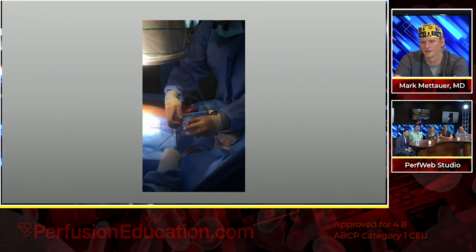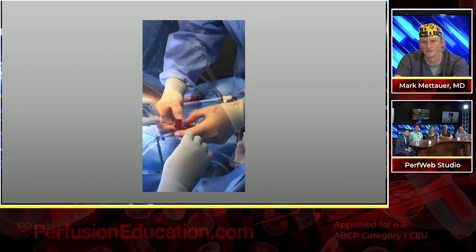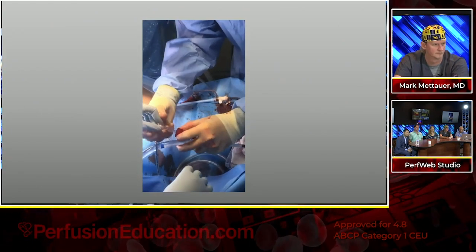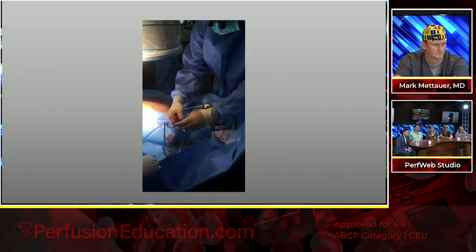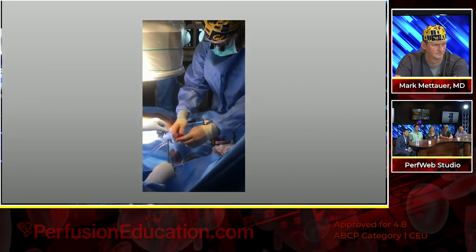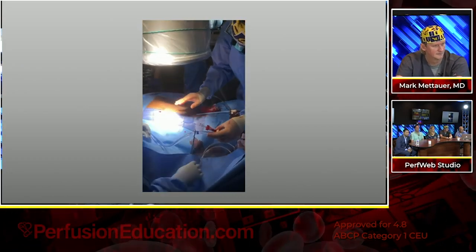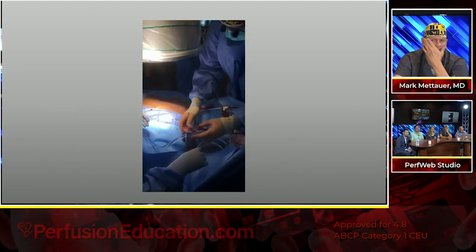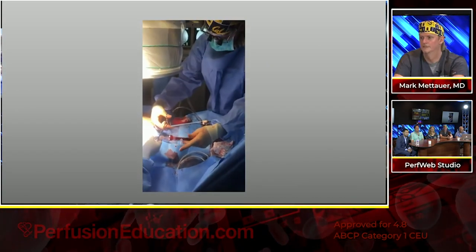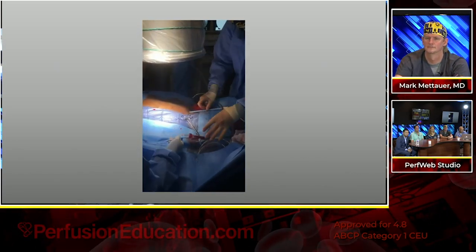So this is your stopper here. That's all this is. So it's like rubbing your tummy and patting your head at the same time to put it in. Hubbed. Yeah, so it should click in. Okay. We saved a few steps today. We didn't do a lot of that stuff today. The clear is also tight. Just go ahead and, yeah, perfect. Good. Okay. Ready? Right. So, take that off. If everybody's comfortable, we can go on.